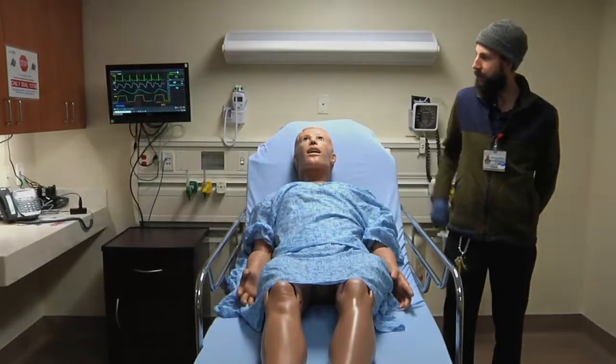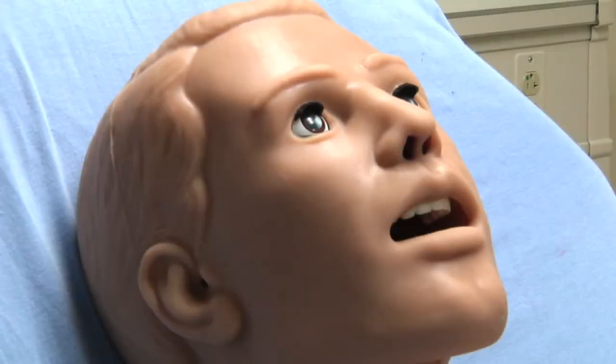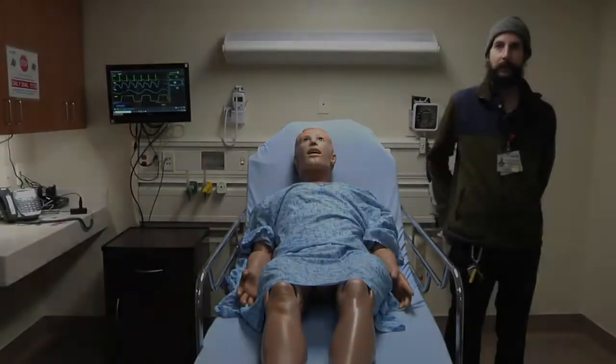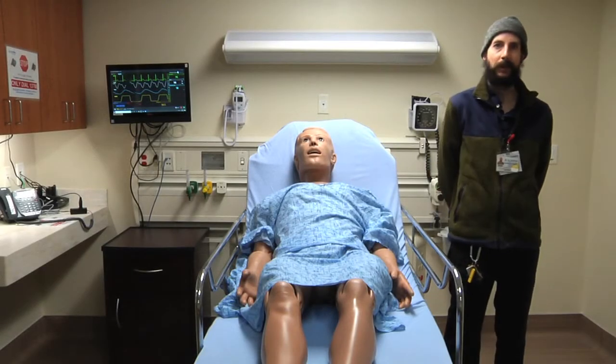So you'll notice that HAL has eyes that can blink. Eyes can be closed depending on his patient condition. So HAL's eyes are also reactive to light.